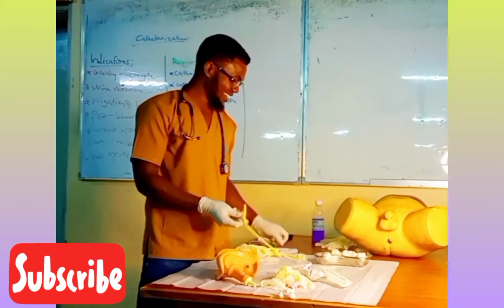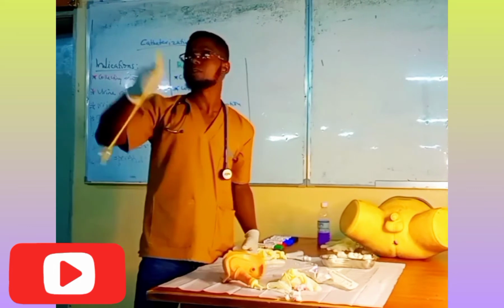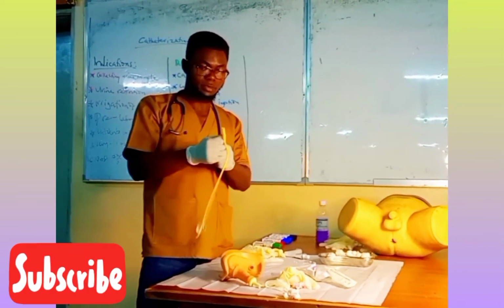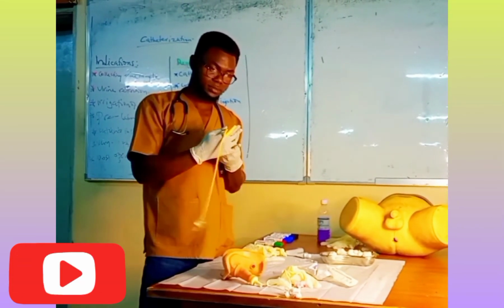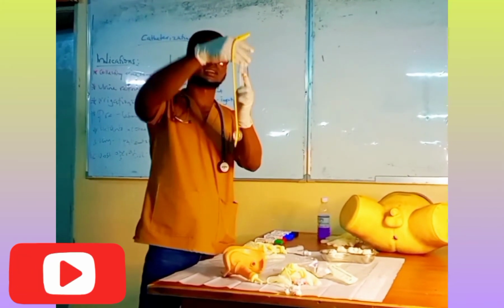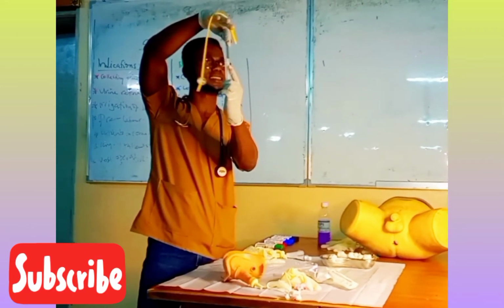Now, when we are removing it from the patient, you bring our syringes. I hope this one is not blocked. You bring our syringe and we suck out the water. So I'm sucking.